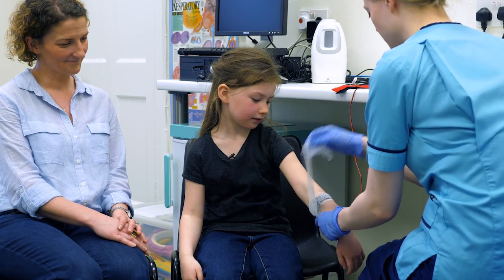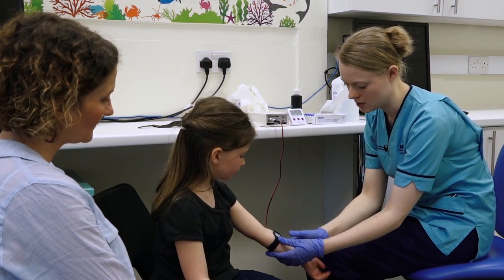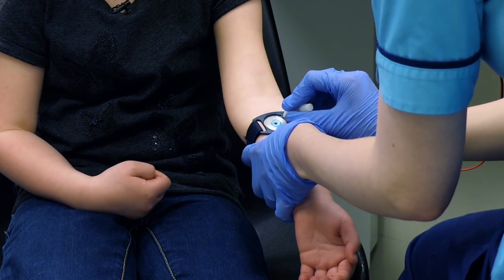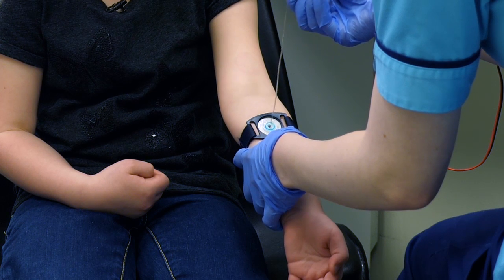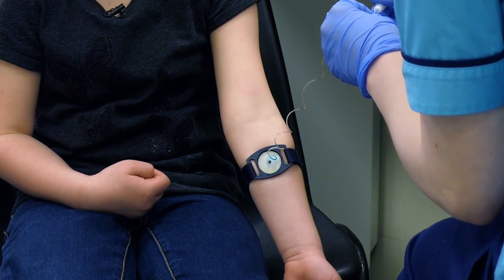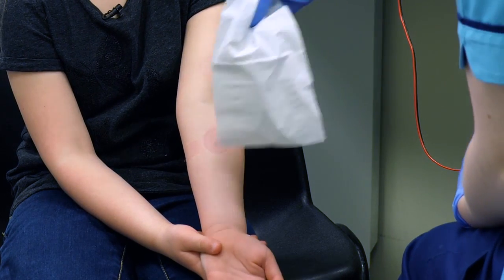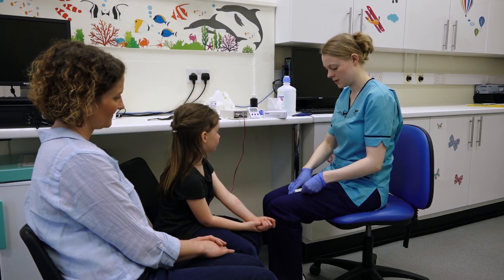So we're going to take your bandage off first. And if you turn your arm round, you can see you've got some sweat — there's a dye in there to make it blue. So your sweat isn't normally blue. I'm going to pop this out and gently pull it out. There we go, and then we can take this off. I've got a bit of blue on my arm. You do have a bit of blue and that'll wash away later. And that redness will fade away as well. And that's the test finished.